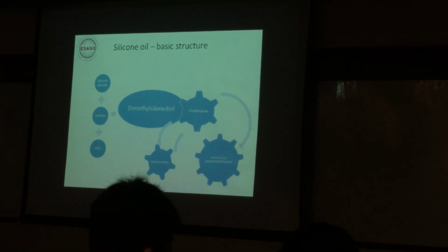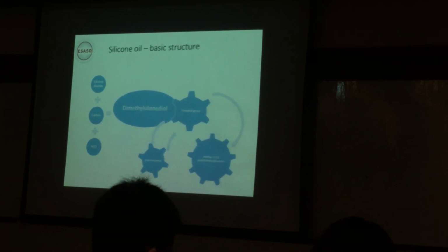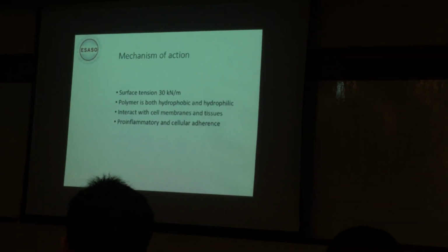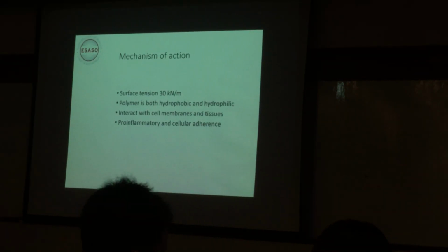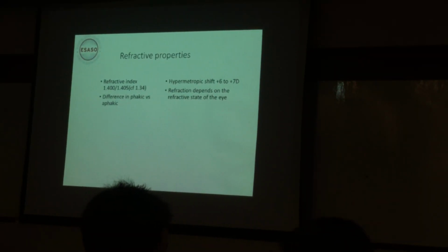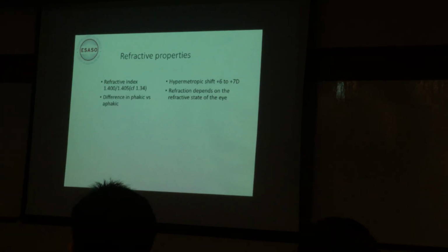This is a chemical structure if you are interested, but the action is both hydrophobic and hydrophilic, and it may interact with cell membranes and tissues, may contain pro-inflammatory factors, and may cause cellular adherence. So some people think that it actually worsens PVR in cases of retinal detachments because it causes inflammation. There is a difference in terms of the refractive properties, so you always have to tell your patients the refraction will change.